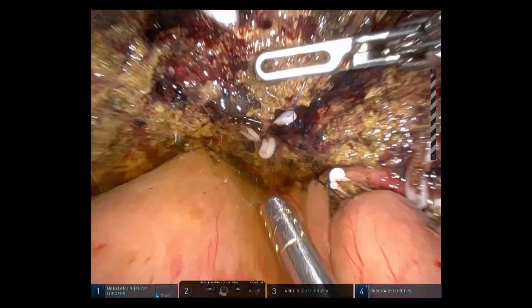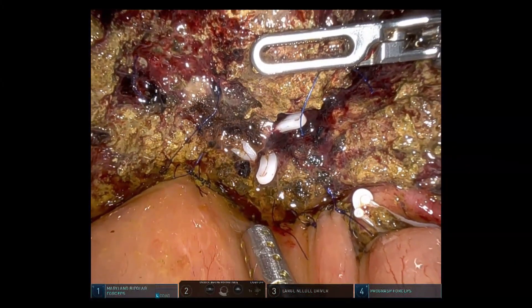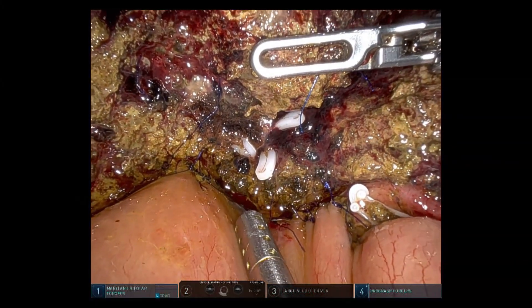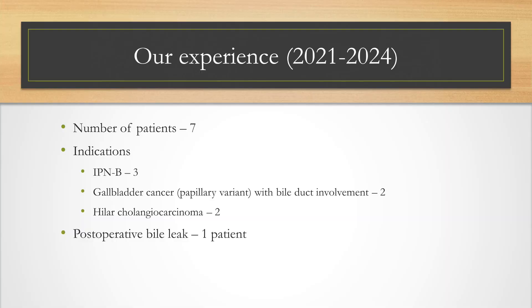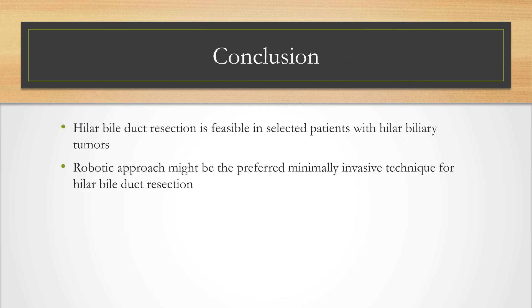This completes the anastomosis. A bile duct leak test is performed. We have performed this procedure in 7 patients with hilar biliary tumors with good postoperative outcomes. Hilar bile duct resection is feasible in selected patients with hilar biliary tumors, and the robotic approach might be the preferred minimally invasive technique for hilar bile duct resection.